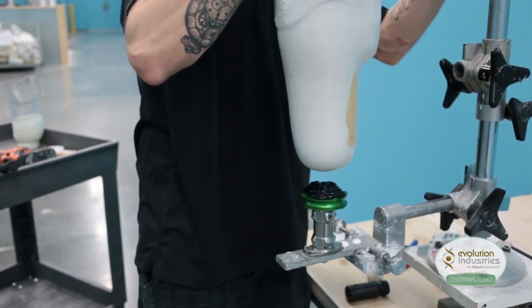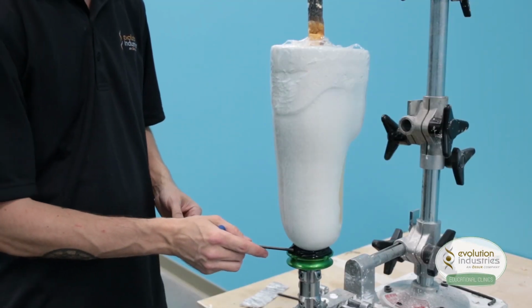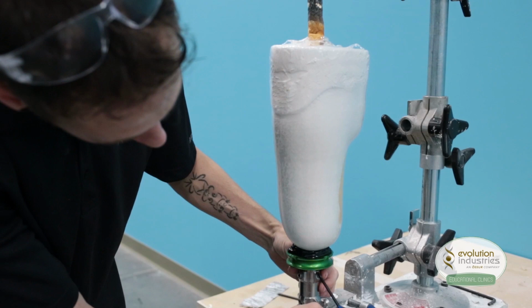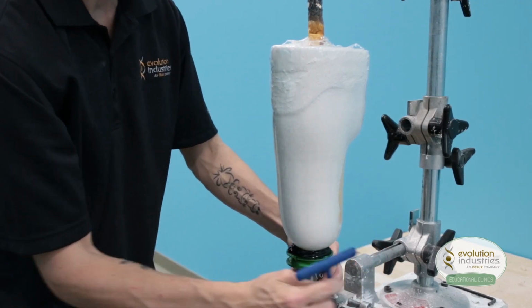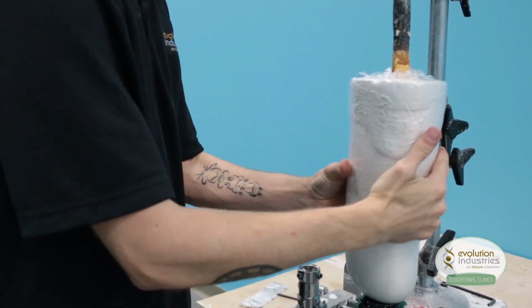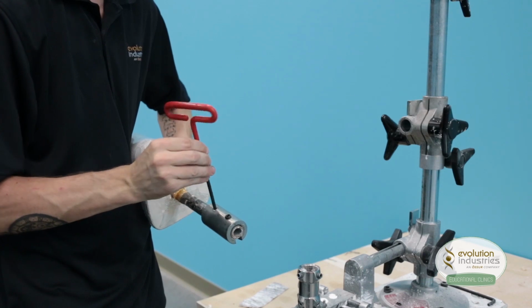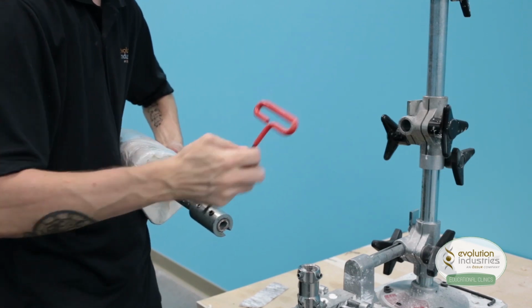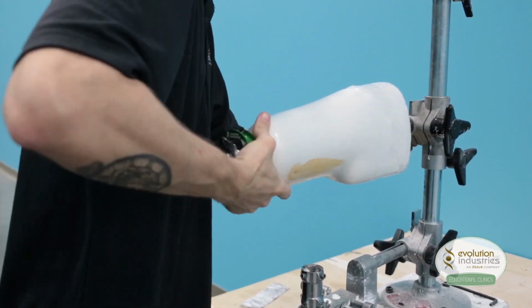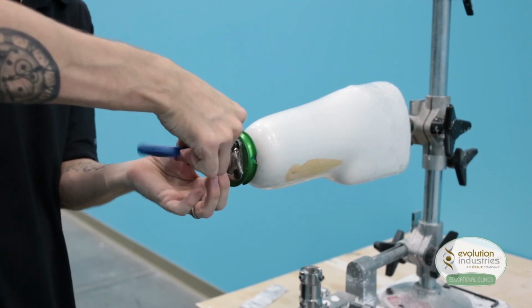Swing our mold back over and drop it straight down, and we allow that to set for about 2 minutes. And once the Evo bond is fully cured, we can remove it from the alignment jig one more time. And we will prepare it for our lamination. To prepare it, all we do is simply remove the pyramid.